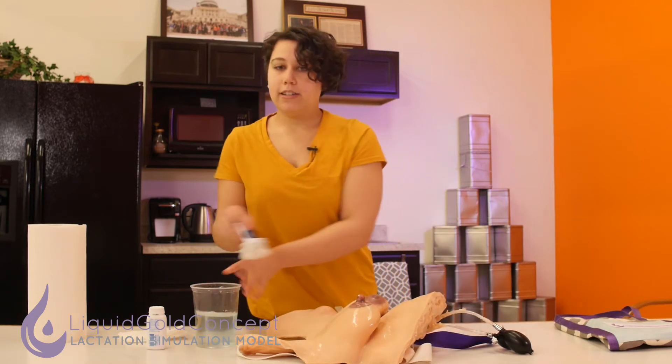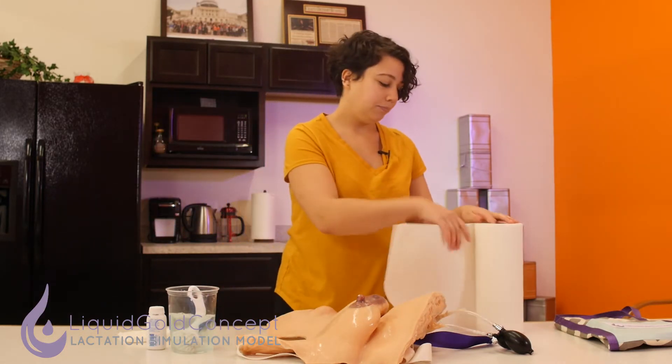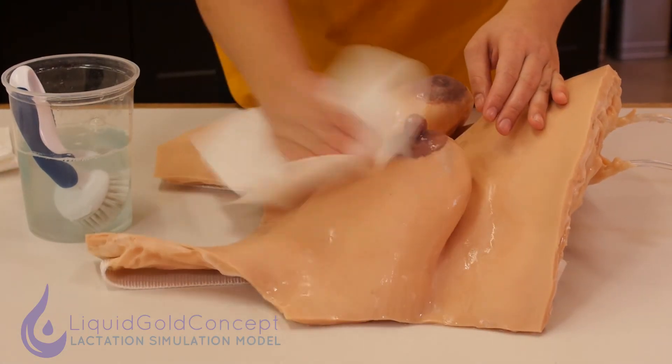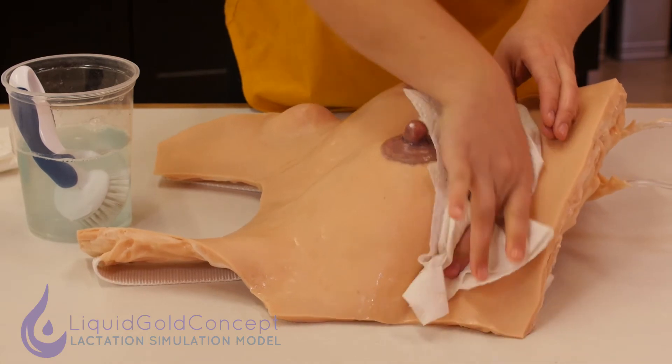Once you've gotten the surface nice and clean, you can go ahead and just take some paper towels and dry her down. When you're doing this, you want to make sure to take care underneath the breast area and make sure that no water is staying there.